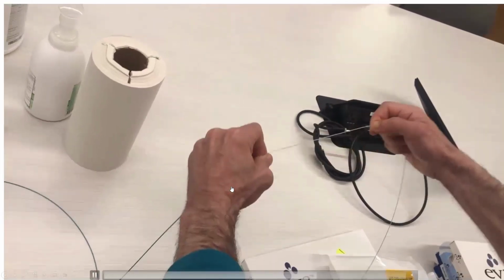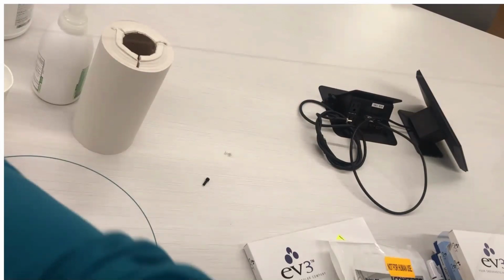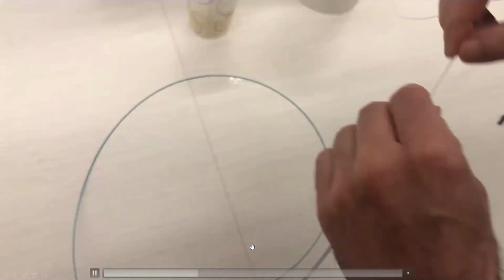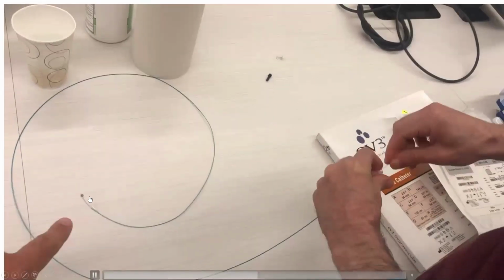And after you've pushed that wire for 10-20 centimeters, you just take out your introducer catheter, which only value was to allow you to load the coils inside the Fine Cross, as it was with our pushable coils. So once those coils are inside the Fine Cross, a few centimeters inside it, you just take out that introducer sheath. Now you keep pushing those coils through the Fine Cross into the perforated branch. And this is how we're pushing the wire all the way through the Fine Cross into the perforated branch.